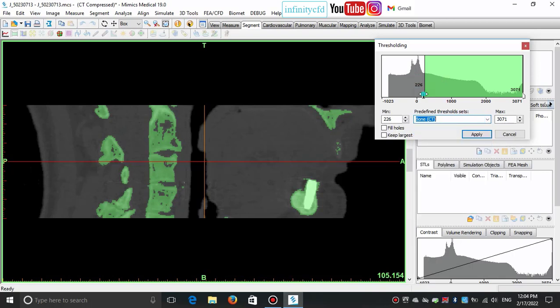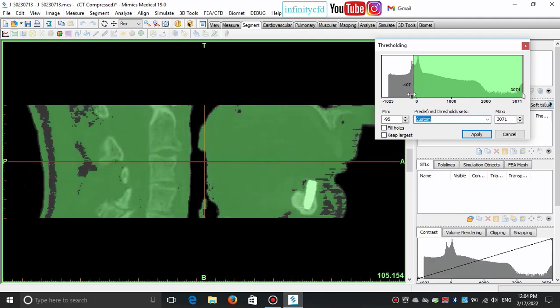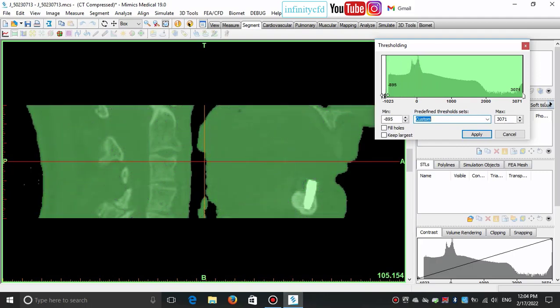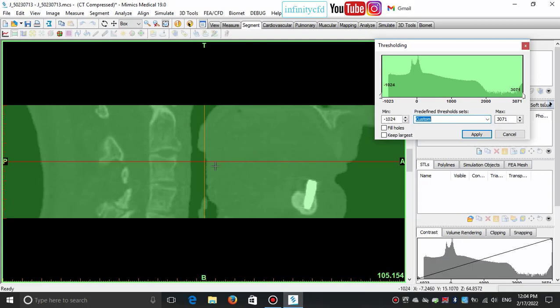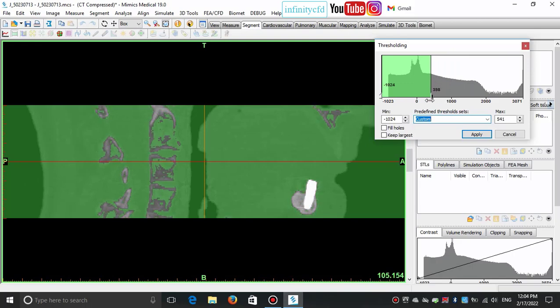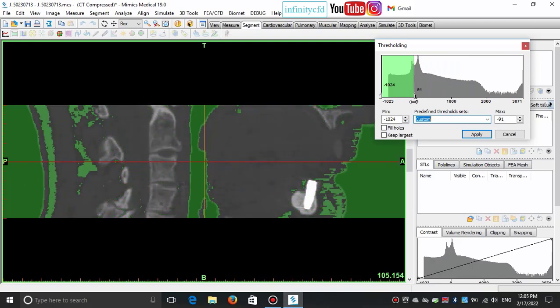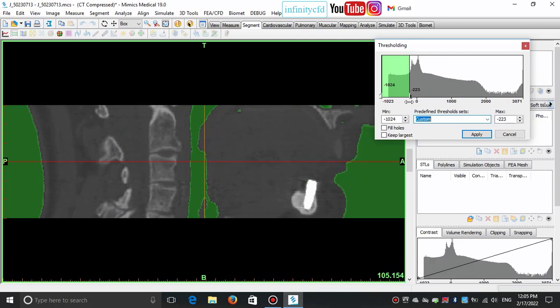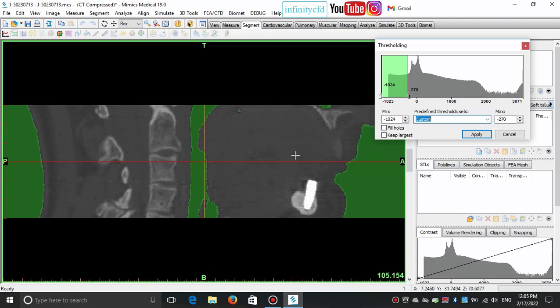You can manually set the threshold by changing the minimum and maximum values. For example, here for capturing the air region, I reduce the minimum value to minus 1024 and I change the maximum value until the air part is well captured. Minus 270 seems a good value.